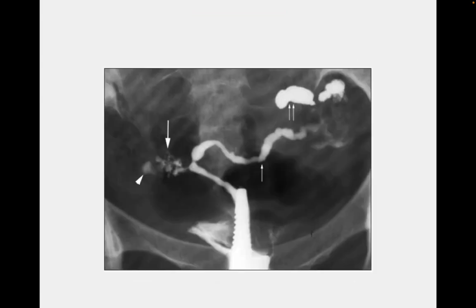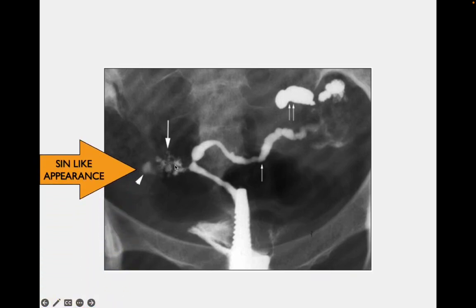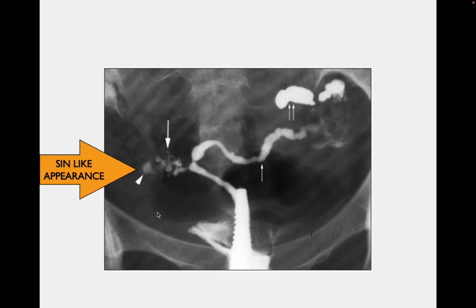In this picture you can see a salpingitis isthmica nodosa (SIN)-like appearance. In SIN, the mucosa of the isthmus forms diverticula that extend into the muscular part of the fallopian tube, especially in the isthmic region. 'Salpingitis' means inflammation of the tube, 'isthmica' because it involves the isthmic region, and 'nodosa' reflects the nodular nature.